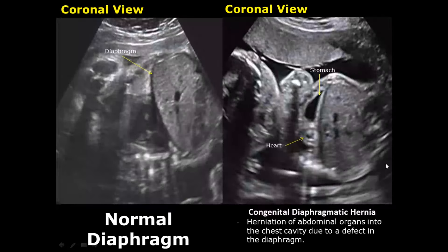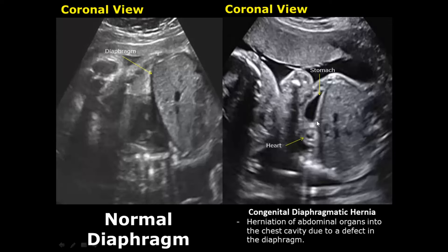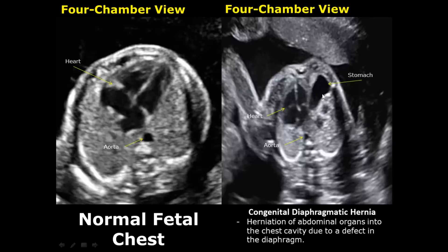A fetal diaphragm appears as a hypoechoic structure between the thoracic and abdominal cavities. In the coronal view, we see the lungs and the heart above the diaphragm. In a congenital diaphragmatic hernia, there is a defect in the diaphragm leading to herniation of abdominal contents — such as the stomach — into the thorax. The stomach appears as an anechoic cystic structure because it is fluid-filled. In the four-chamber view, we can see the stomach right next to the heart, and the heart is also displaced towards the right side.